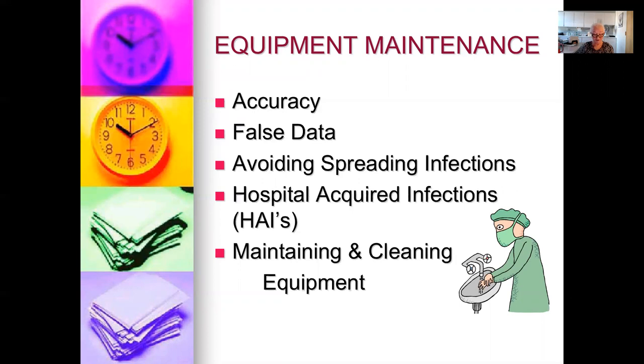For the tympanic ear or forehead monitor, wipe the area used on the client with an alcohol pad. Use friction to remove dirt, grime, blood, and pathogens. Wash hands after removing gloves and allow the monitor to air dry before using again. One thing I want to remind you when you're using these cleaning agents, even if you're using the McKesson, you need to be wearing gloves so that you're not getting this onto your skin. It also dries out your skin very badly. For the pulse oximeter, O2 sat monitor, wipe the inside finger area with an alcohol swab using gloves. Remove gloves, wash hands, and allow the monitor to dry before using again.